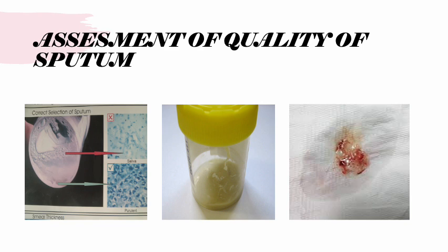And then on the right part is a blood-stained sputum. We can process a blood-stained sputum, provided that the sputum is not subjected to Xpert MTB/RIF. If it is blood-tinged, usually the part without the blood tinge is the one subjected to Xpert MTB/RIF.